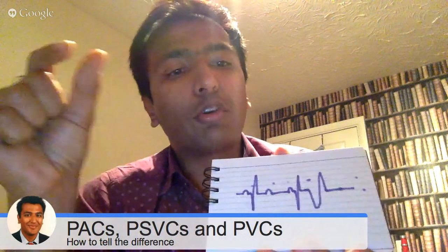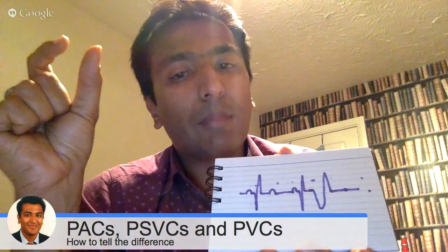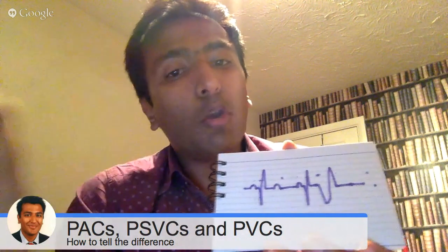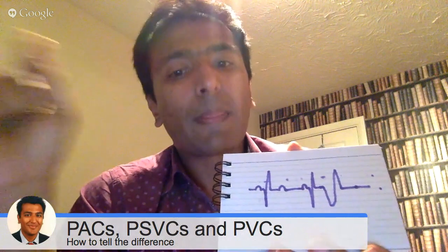narrow complex, then you could call them multifocal supraventricular complexes. And if they are broad complex, then you know they're ventricular complexes. If they are broad complex and they all look different, then you know they're multifocal ventricular complexes.